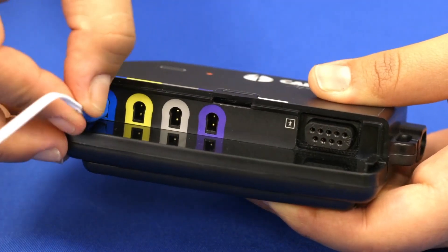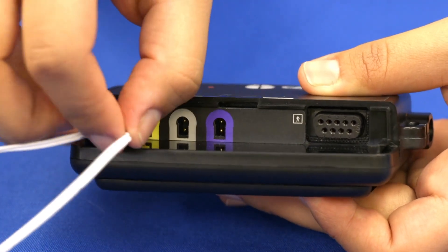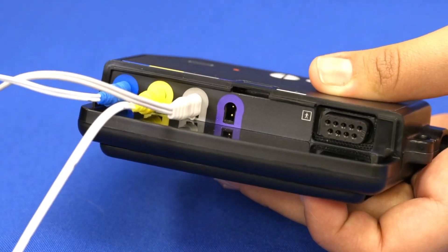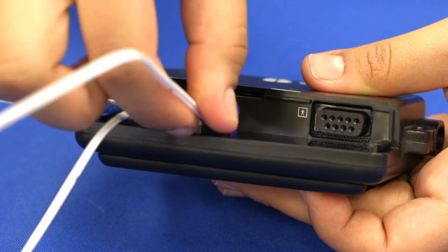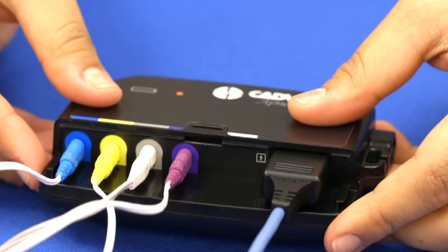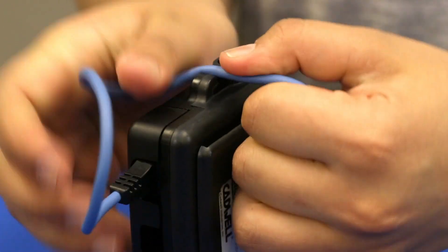Connect the blue input from the chest belt cable into the blue port. Connect the yellow input from the abdomen belt cable into the yellow port. Connect the gray input on the thermal sensor cable into the gray port. Connect the purple input on the snore sensor cable into the purple port. Plug the black connector from the finger oximeter sensor into the black port. Replace the port cover, then press the oximeter cable through the hook on the side of the apnea track.